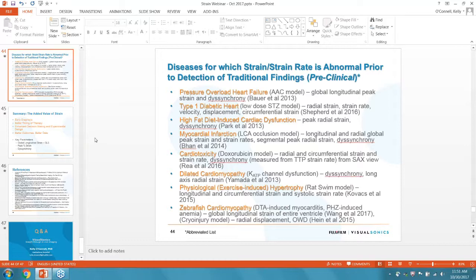A question, actually, an interesting question, again, something that I hadn't thought of, but it seems obvious when you read the question. It is asking about the dependence of strain on blood pressure and any other factors. Any thoughts on normalizing some of the numbers to blood pressure, taking blood pressure measurements? Yeah, that's a good question, and it's something that we deal with in ultrasound and echocardiography.